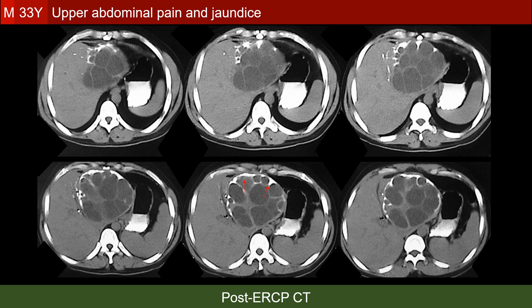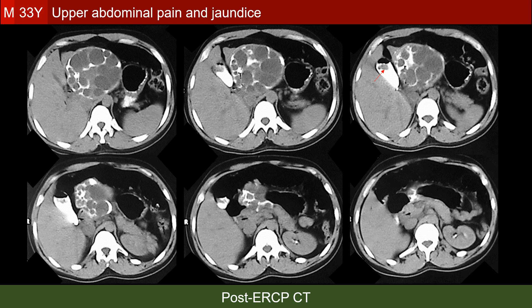The patient was taken immediately from the ERCP room to CT, and CT was performed showing the contrast medium within the hydatid cyst, proving that this hydatid cyst has ruptured into the bile ducts. Note also the presence of some products of the cyst within the bile ducts.